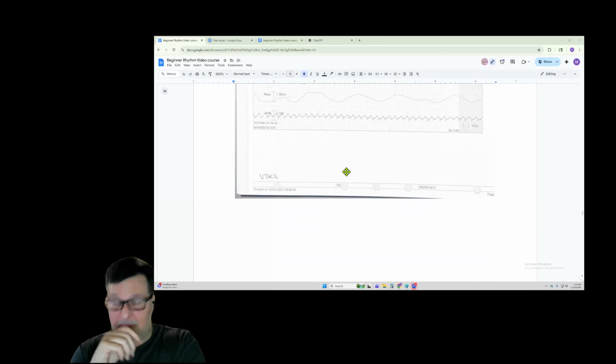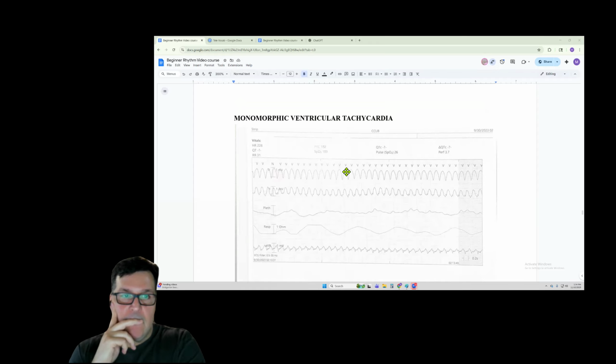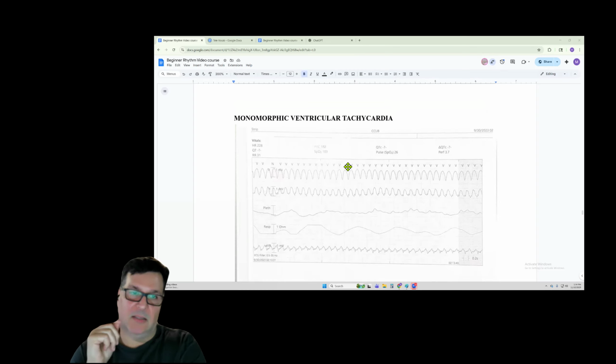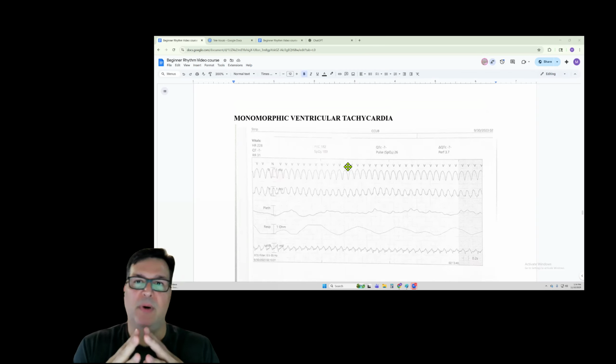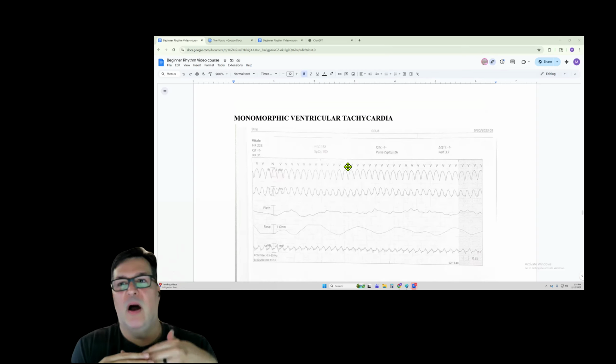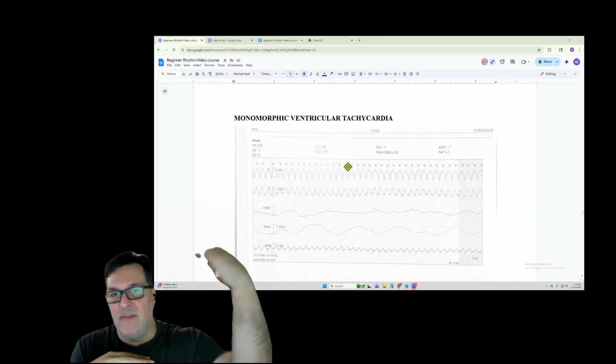And then just to keep me straight, supraventricular tachycardia is also a bunch of, oh, that's PACs in a row. We're talking about PVCs now. Okay. And think of that word supraventricular tachycardia: supra, above. So it's above the ventricles.